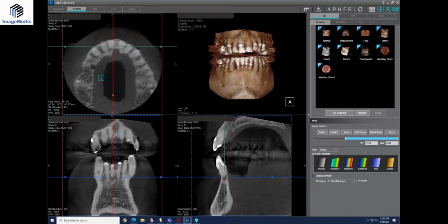To your point, imagine if the patient, a layperson who is asymptomatic, has no reason to think there's anything wrong. And if you just showed him the 2D radiographs, even if, let's say, you were aware there was a problem as the dental professional, it's hard to convince the patient, yeah, no, you should really take care of this because this is bad. Yeah, looking at the 2D picture, especially for a layman, he would say, I don't see anything wrong with that. Right. Looks fine to me. Right. Yeah, it does not look that bad on a 2D picture.